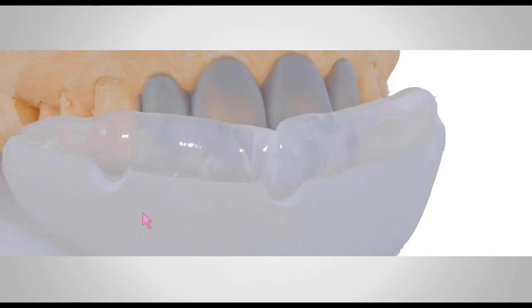If you let go of the triad tray, the triad tray will sink and touch your wax up, and you don't want that to happen. So just keep it in place. Just hold it with your hand until it polymerizes. It only takes a couple of minutes for the clear PVS to polymerize.